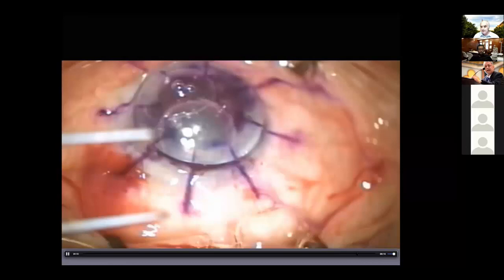And after you remove the cataract in a closed microsurgical technique, you implant the intraocular lens, and then you look for putting the graft. And here, because this is a lamellar surgery, I will make use of the graft to take a DMEK graft as well that I'm going to use in another patient. So the whole idea here is that you should evaluate the corneal opacity and decide which is best for the patient. Okay, and then you put the graft.